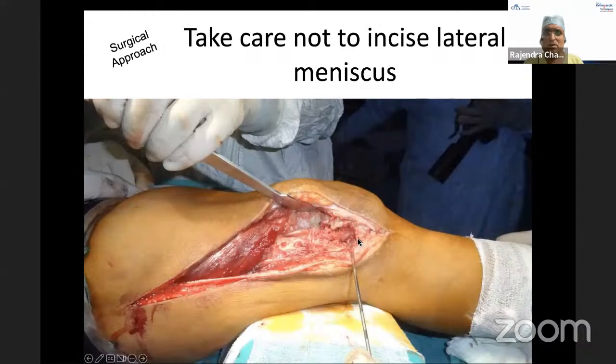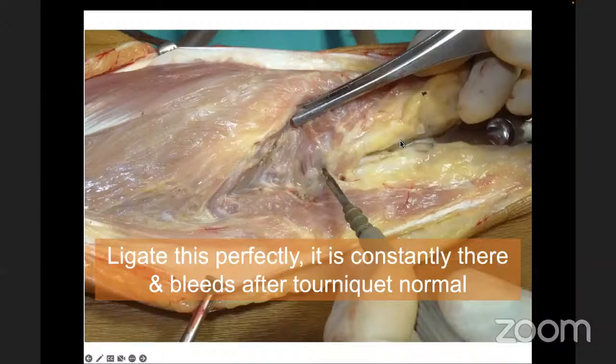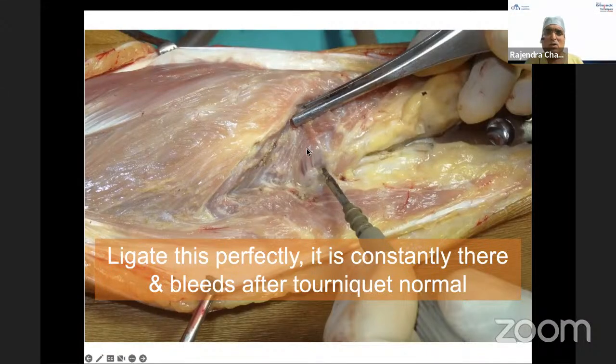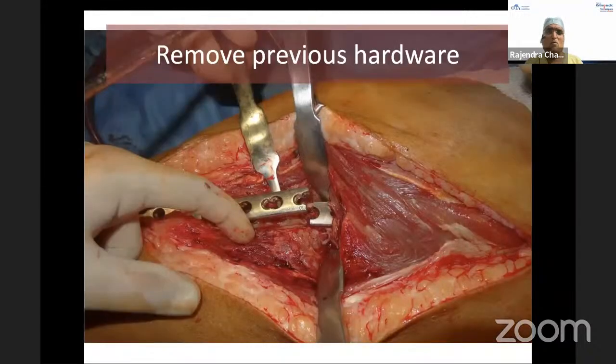Take care, very distally you don't go, so that you don't incise the lateral meniscus. So you incise, see the field. Usually there are vessels when you come to the distal femur plate, so you can coagulate or ligate them. This is the distal perforator, and lower down you have the genicular. You can coagulate them so that you don't face unnecessary bleeding, and you can always find them every time. I ligate them before I go for dissection, and then use an appropriate length of incision whenever you are dissecting a non-union, so that you can adequately find out what is happening.